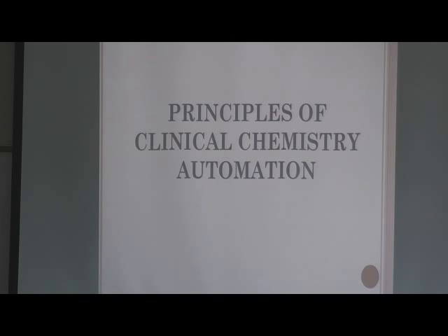So, principles of clinical chemistry automation. Like I told you previously, the clinical chemistry lab pretty much is automated. At North Florida, it's one big machine where you stick the tube in, and I got a video of a similar lab on here where it scans the barcode, which tells it what tests need to be run, then it sends it to a centrifuge and centrifuges it, then sends it to individual machines to take samples of the supernatant, and then test it for whatever was required. So it's kind of interesting.